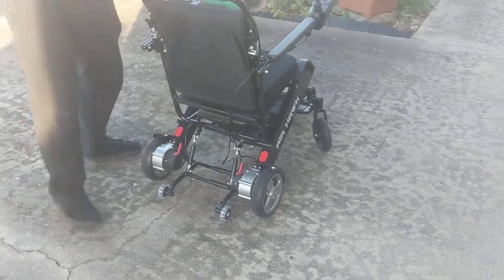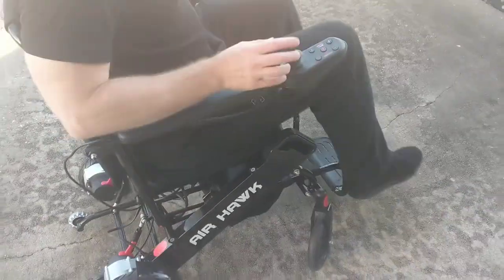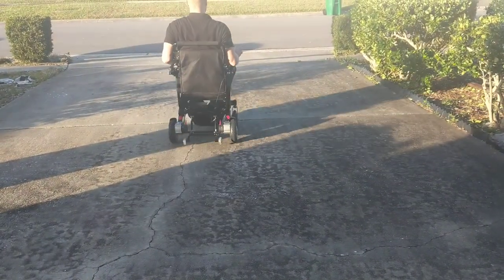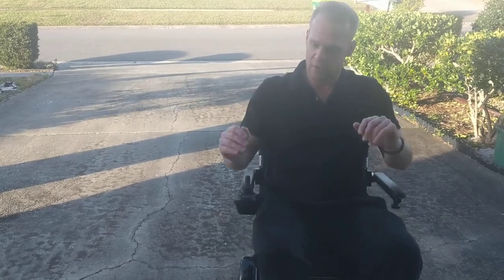To turn this back into an electric chair, we lock the chair and turn the power on. The chair is ready to be very easily and very effectively an electric chair that works fantastically.